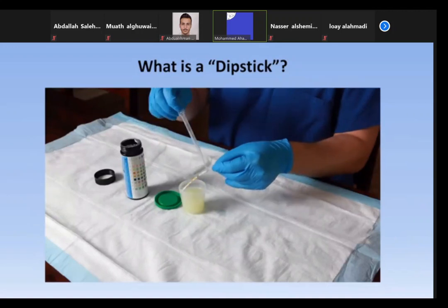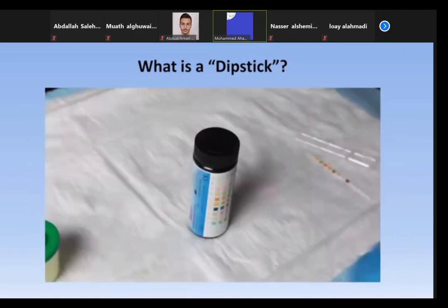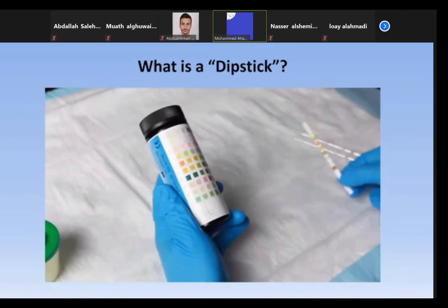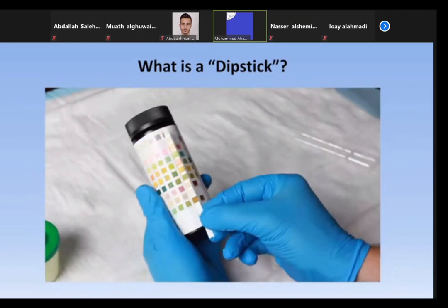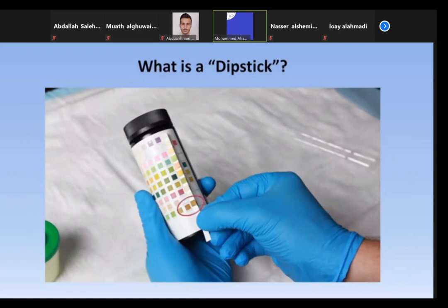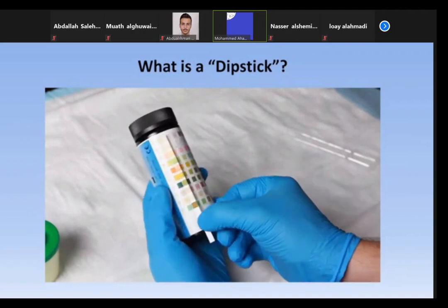At this point, compare the colors of the individual pads against the standards that are provided. So for example, focusing on the bottom pad, which corresponds to glucose, we are trying to match the tan color on the strip with one of the colors in the bottom row on the standards. And it seems to match the second to last one pretty well, which corresponds qualitatively to 3+ out of a possible 4+ scale. We then repeat this process for each pad, moving up the strip.